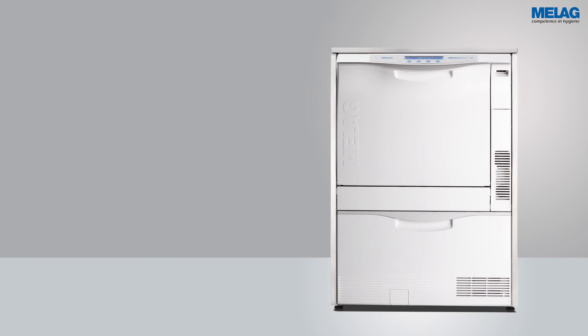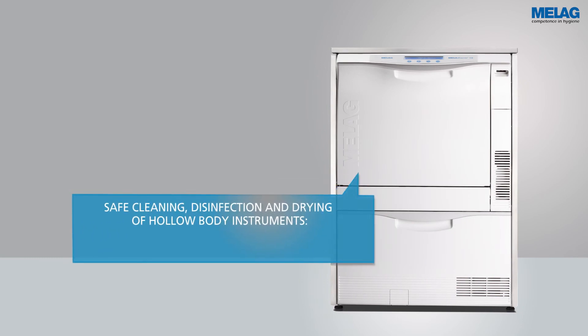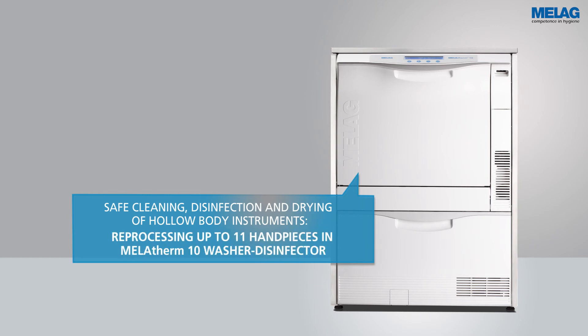The innovative washer disinfector Melatherm 10 achieves safe cleaning, disinfection, and drying of up to 11 handpieces in a single batch.